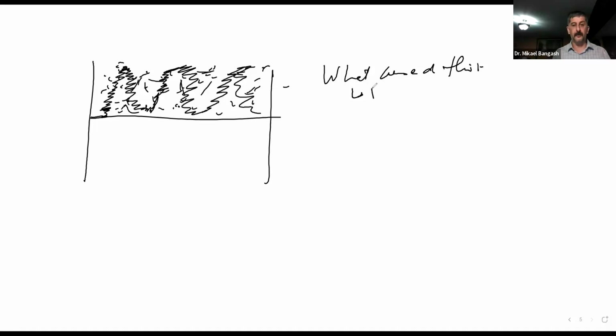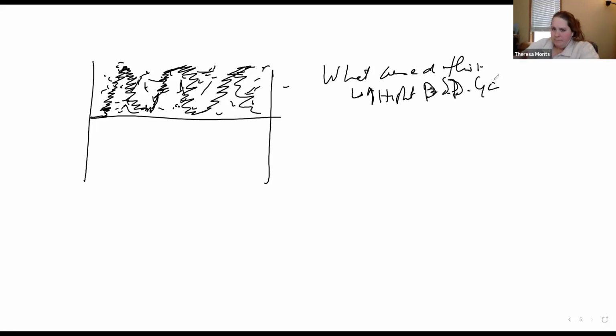You should be giving us an image or an option that says okay, too much or too high. Sorry, spectral Doppler gain. Is that clear? Yep. Good.